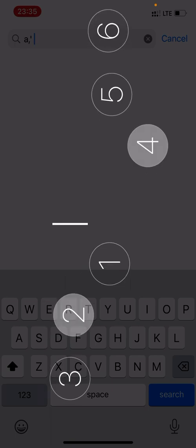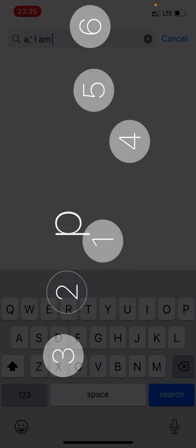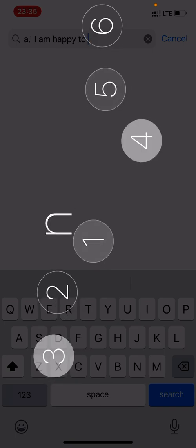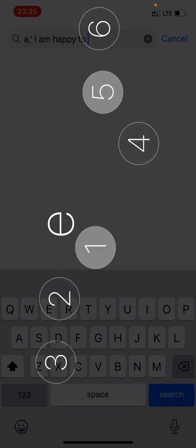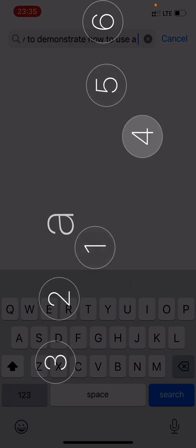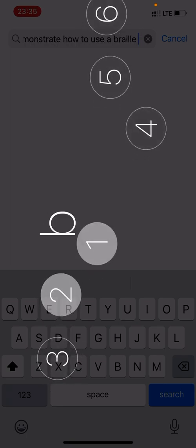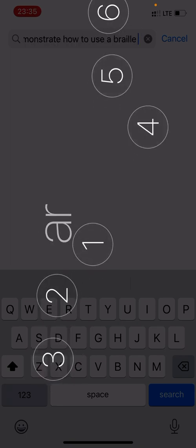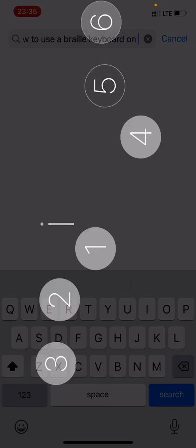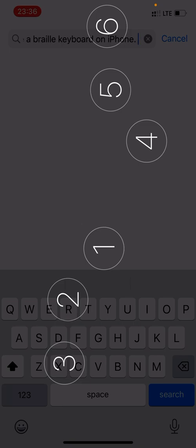And now here we can just type. For example, typing 'I am at a demo to demonstrate how to use a braille keyboard on iPhone.' The device reads out each character as it is entered using the braille dot combinations.